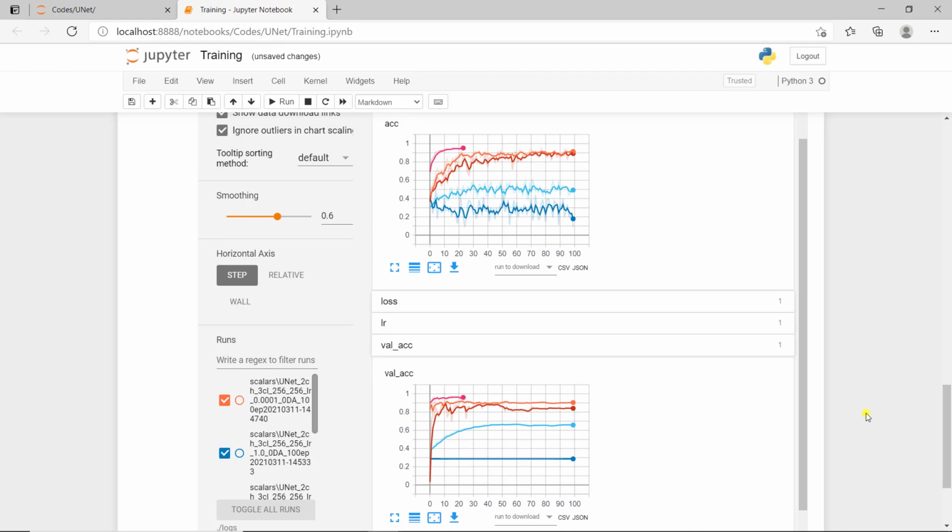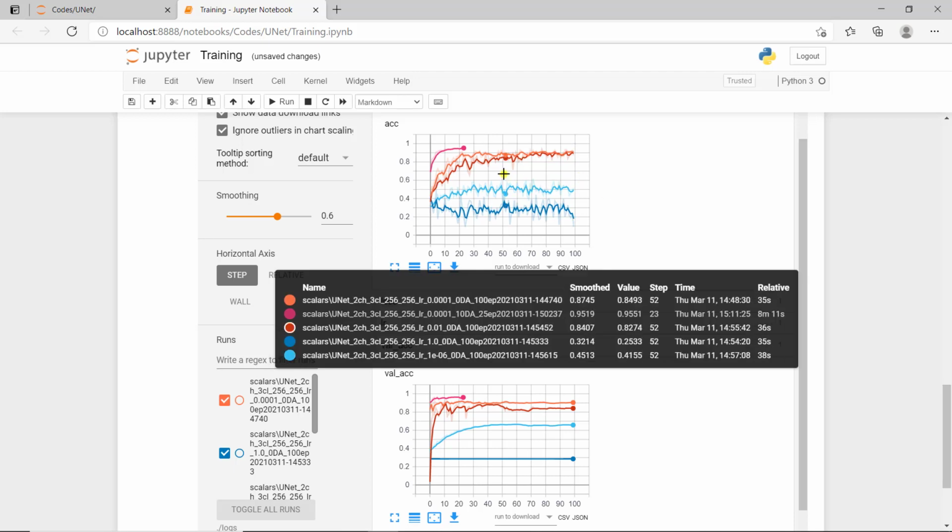All right, it's done. So if we look at the results, it corresponds to the magenta curve. Clearly, the accuracy on the training dataset is higher, so it converges faster, which is not a surprise because we use much more data. So it's not surprising that it converges faster than when we don't do data augmentation. But even with that, we end up with something around 0.95, which is definitely better than what we had before, around 0.9.